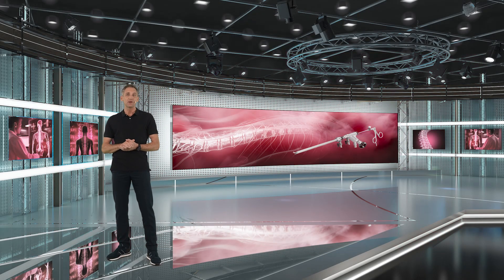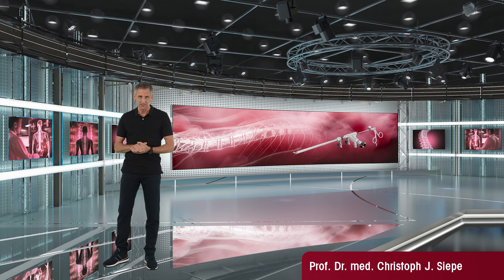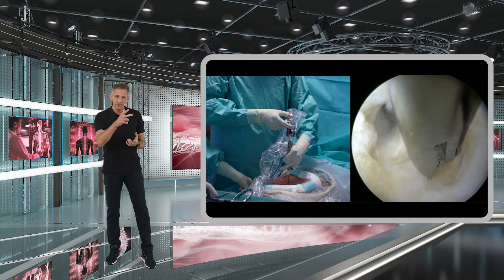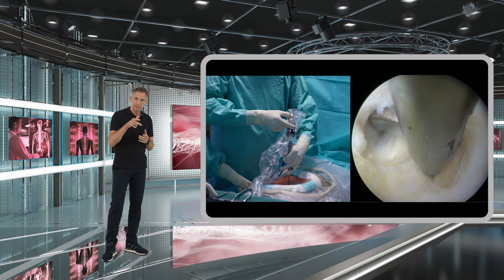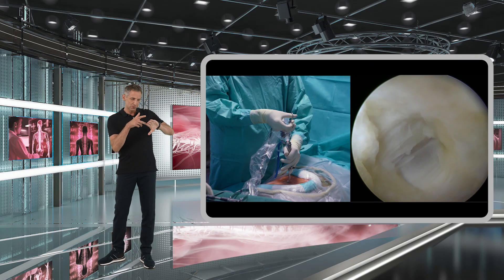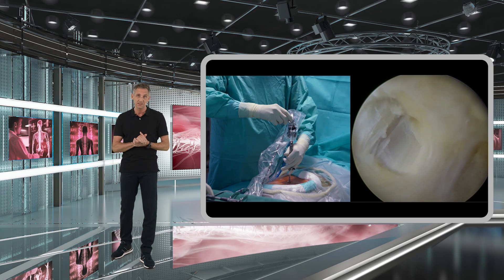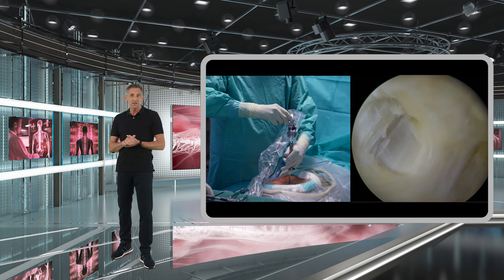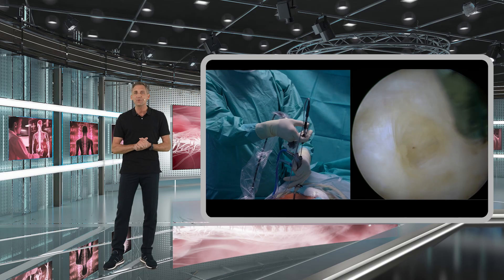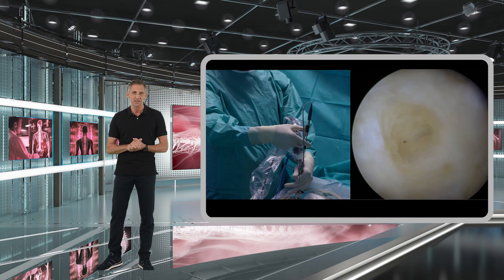The opening of the yellow ligament can be done with sharp scissors. The mouth of the scissors is opened widely and gently and pushed against the yellow ligament. This should be done perpendicular to the fibers of the yellow ligament, because then you can cut better and take better bites. At the same time you can also use the bipolar to shrink some of the surrounding soft tissues, which will provide better visualization.